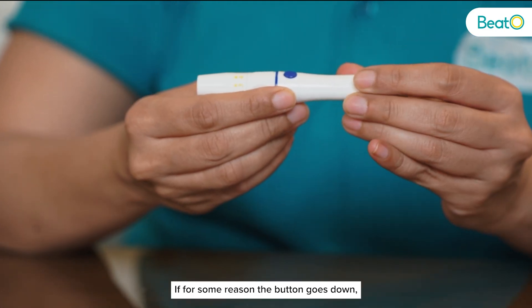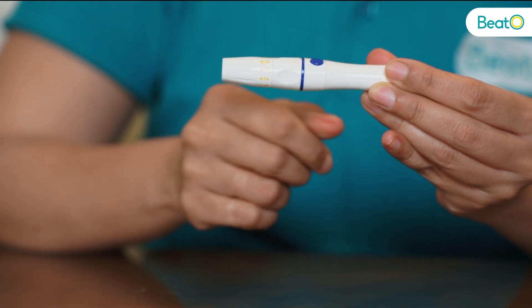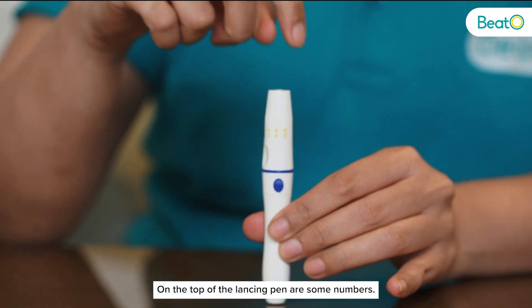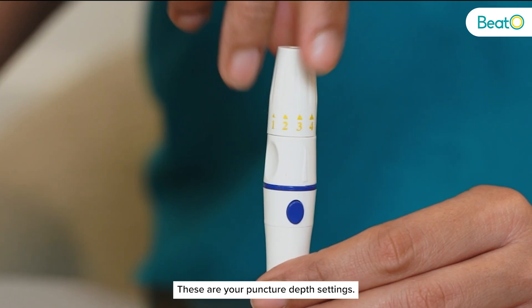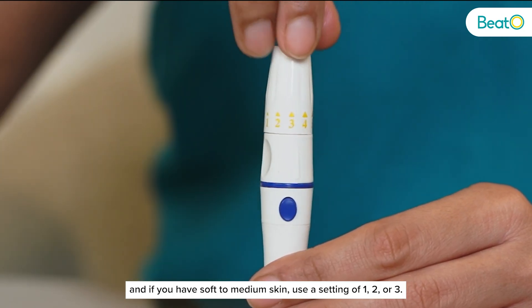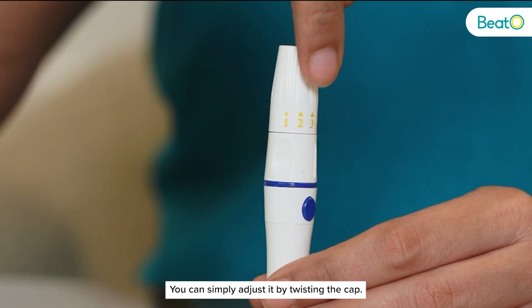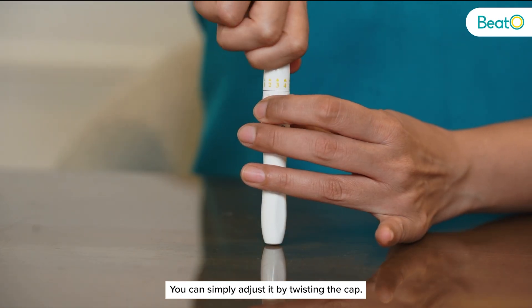If for some reason the button goes down, you can simply pull the trigger like this and get the button up again. On the top of your lancing pen are some numbers — these are your puncture depth settings. If you have hard skin use a setting of 4 or 5, and if you have soft to medium skin use a setting of 1, 2 or 3. You can simply adjust it by twisting the cap.